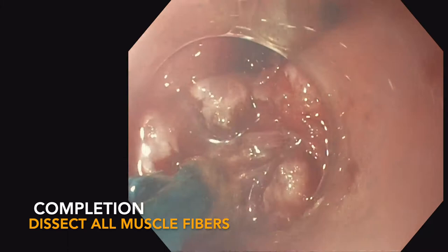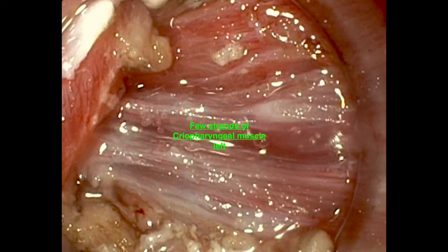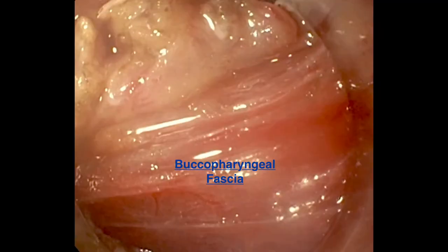Here you're starting to see the last final layers of the cricopharyngeal muscle, and you can see just a few strands left, along with this white film-like layer, which is the buccopharyngeal fascia. It's very important to recognize the buccopharyngeal fascia and dissect all of the final muscle fibers. Here you're seeing final completion of that dissection. Ear, nose, and throat physicians are very familiar with the buccopharyngeal fascia, while those with a background in general surgery or gastroenterology may be less familiar — it's important to recognize this layer for complete dissection.